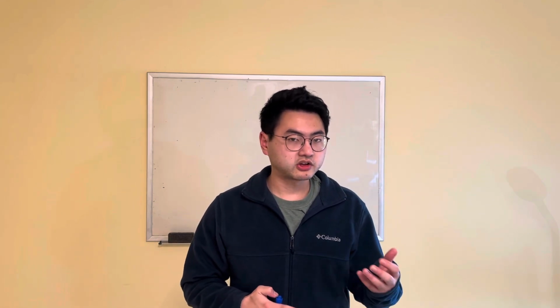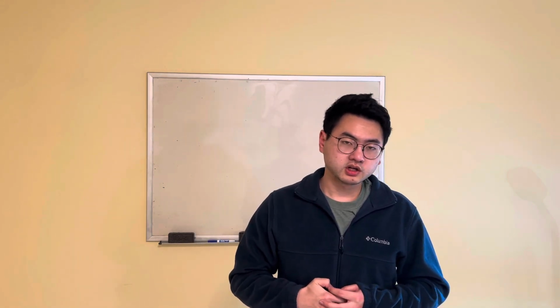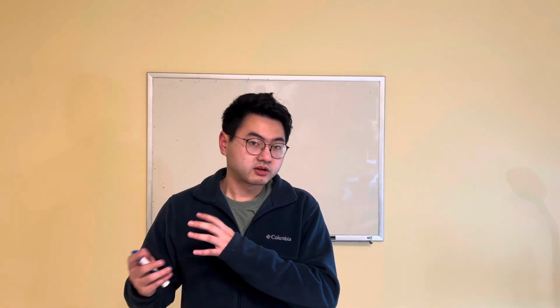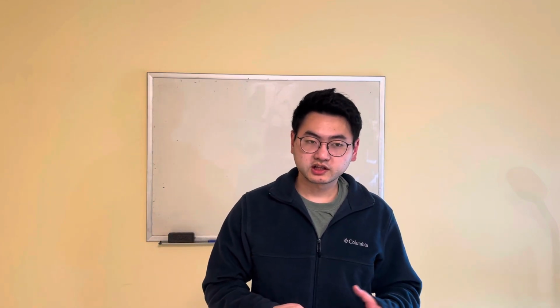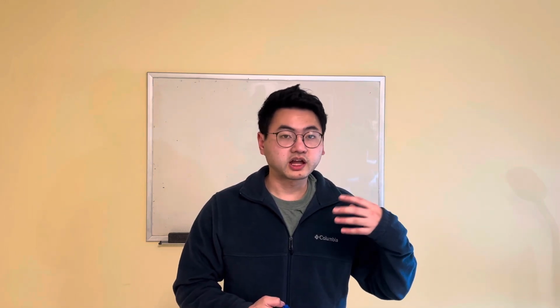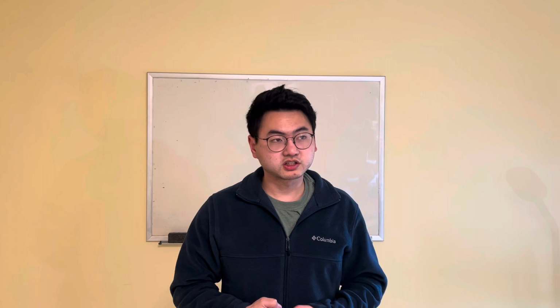And I'll be showing how you can think about these and how you can calculate one from the other, the peak pressure and the plateau pressure, and then how you can figure out what kind of problem you have as a result. So a good rule of thumb is if it's a plateau problem, then it's a compliance problem. If it's a resistance problem, that's going to be somewhere in your airway, whether it be the tubing or the endotracheal tube, if there's a kink, if there's an obstruction, if it's too small, if there's biting on it, if there's bronchospasm, if there's mucus plugging.